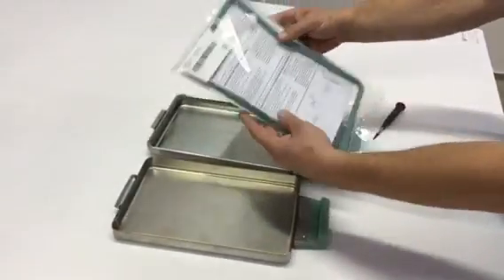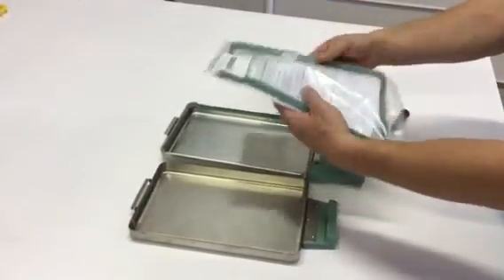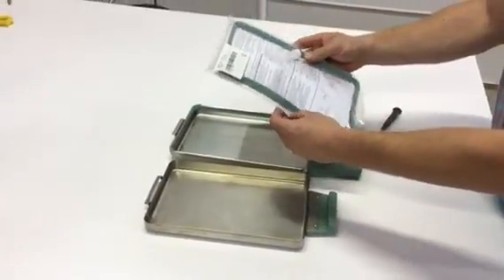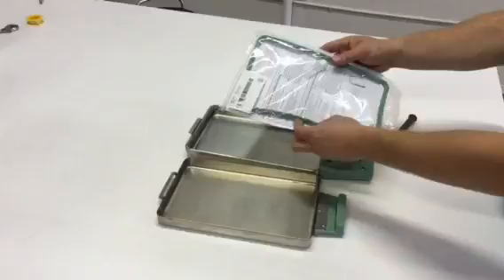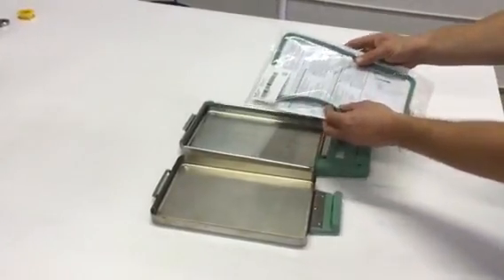Number one, you always want to buy the manufacturer seal. You do not want to buy the replacement seals. They work, but they need to be replaced more often and could cause leakage underneath the cover, which could cause other problems.